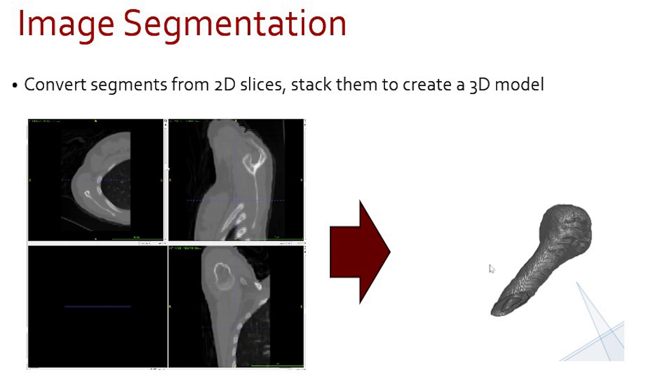In this video, I'm going to use the example of a glenohumeral joint for the shoulder. My goal is to create a segment of the superior portion of the humerus and the humeral head.